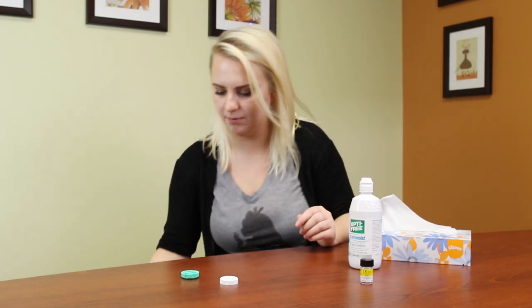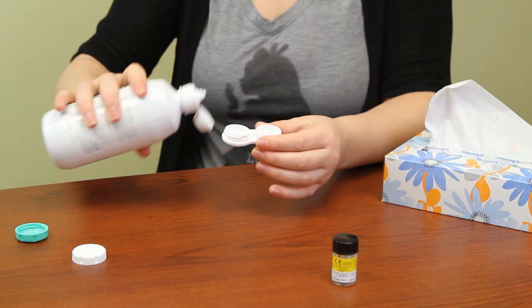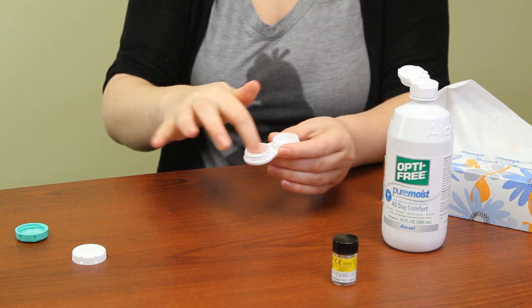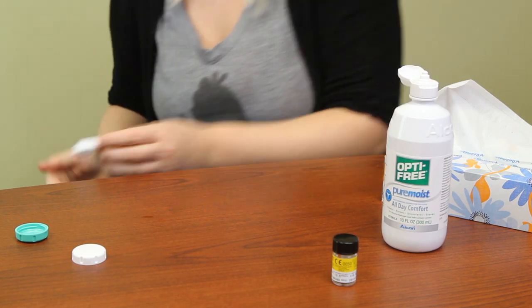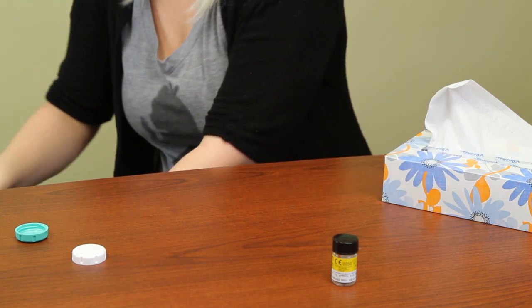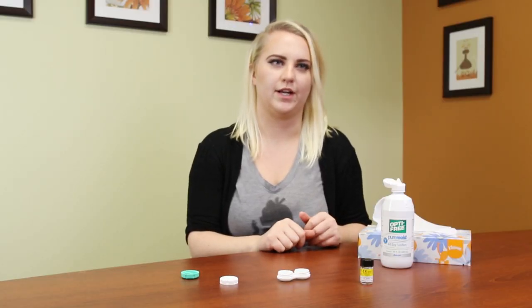When you are ready to clean your case after you put the contact lens in, dump out the old solution and put some fresh solution in there. Just rub it out with your finger, then dump it out and rinse it with a steady stream of fresh solution. Dump that out and leave it out to air dry overnight, so that way it's ready for the next time you need it.